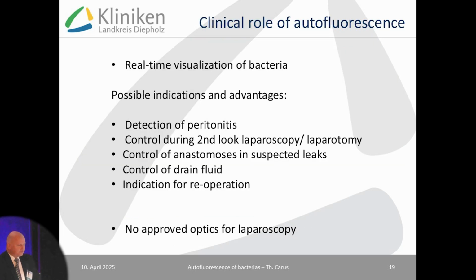What's the clinical role of this relatively new thing? I think it's the only possibility to visualize bacteria live during operations. You all know, I had some situations before. I wanted to do a TAPP procedure with a mesh implant, and I looked into the abdomen and saw creamy fluid like pus. I took a sample, stopped the operation, no mesh implant. It was Friday, the result came on Tuesday, it was sterile. Then Wednesday, next operation, I implanted the mesh.